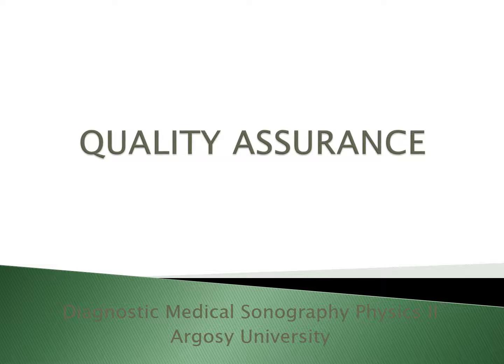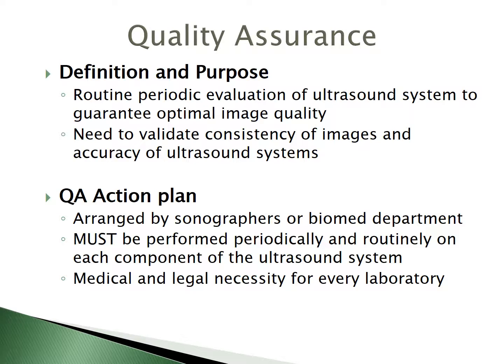This lecture will cover quality assurance in ultrasound. So what is quality assurance? Well, we define it as routine, periodic evaluation of an ultrasound system to guarantee optimal image quality. We need it to validate consistency of images and the accuracy of the ultrasound system.